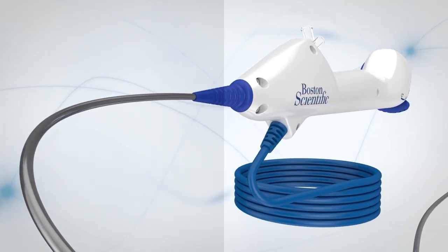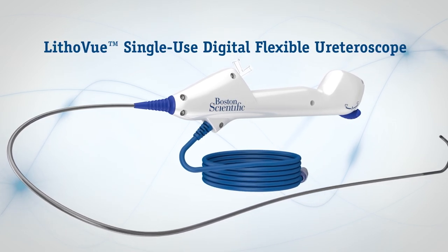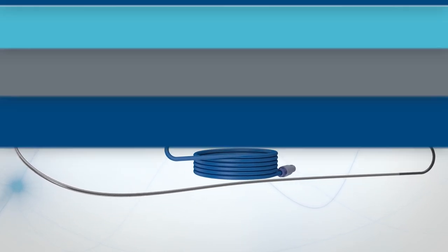Frustrations like that are a thing of the past with the LithoVue single-use digital flexible ureteroscope. Manage your cases as you always have, but with no repairs, no sterilization, no compromise.